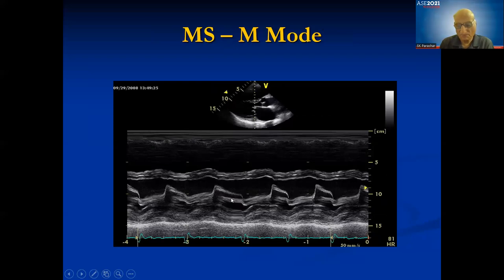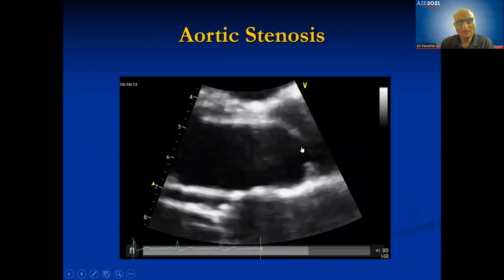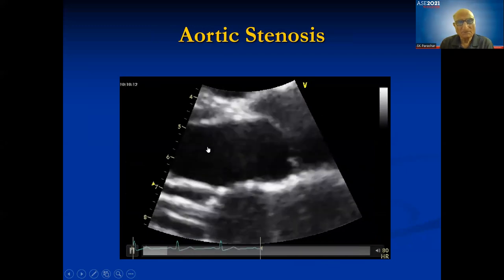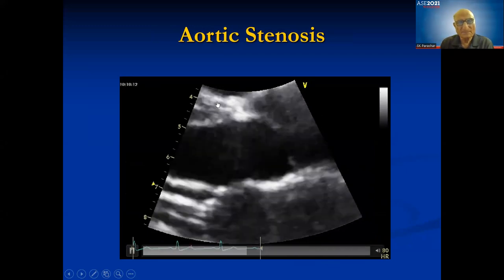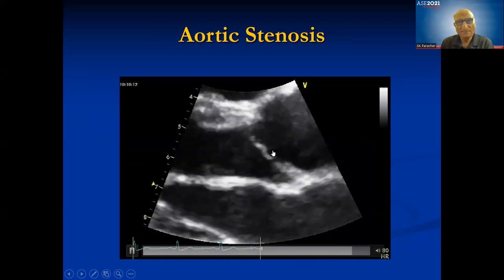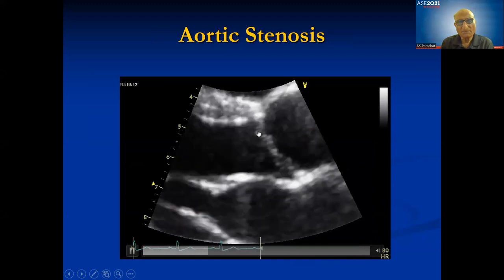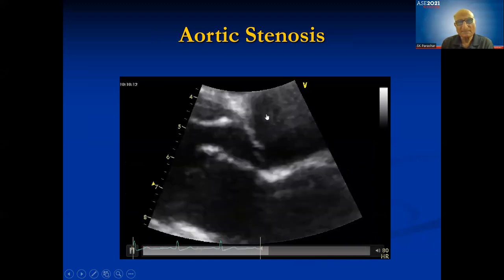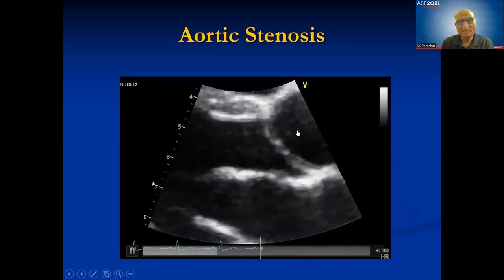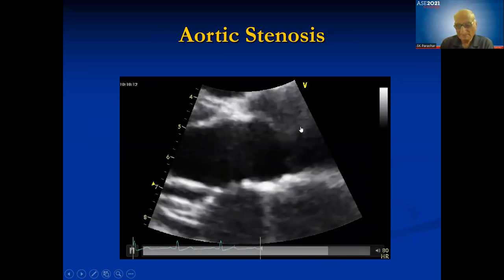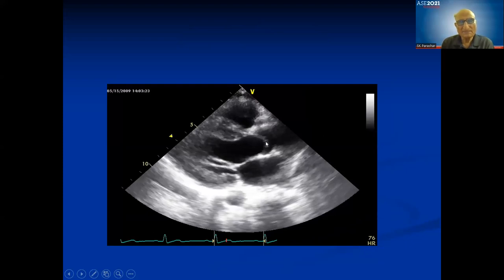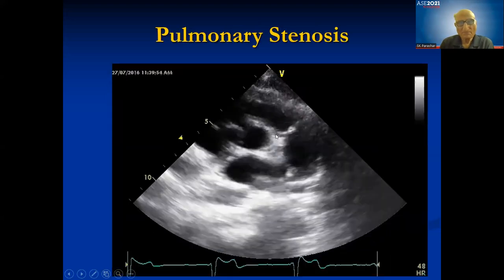In aortic stenosis you see doming of the aortic cusps — a zoomed view shows the cusp doming with convexity toward the aorta, the distal chamber. Both still images and cine loops demonstrate this doming clearly. The principle is the same: thickening of the cusp, restricted opening, and doming toward the distal chamber.